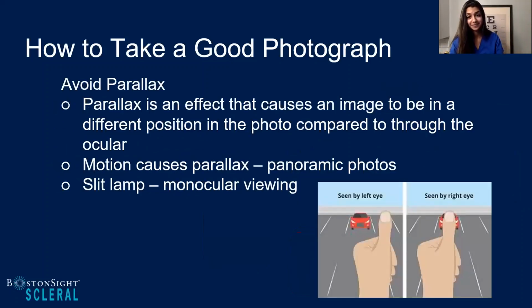Parallax. Parallax is something that I just want to bring up so that you know to look out for it and watch for it. This is kind of tricky to explain, but it can happen when you're taking an image and the image that you're looking at looks shifted in the actual photograph. It happens sometimes when there's movement in your camera with your shaky hands, Avani, or when you are looking through an ocular with one eye and you're taking an image with the other eye.